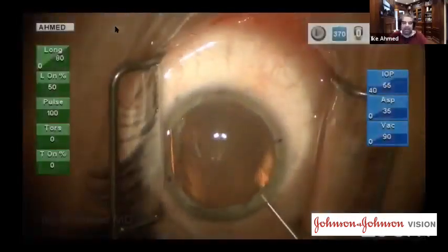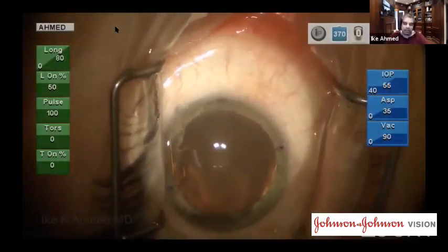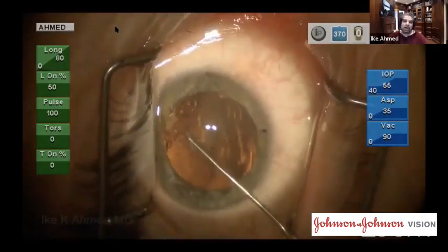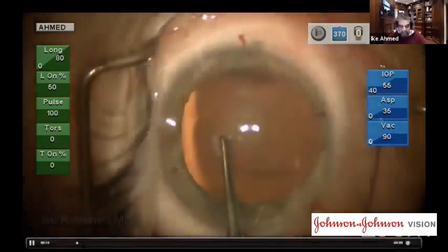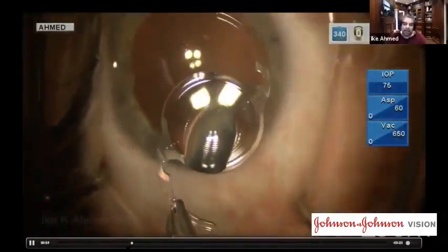This patient came to me with a traumatic cataract and an atonic pupil, was wearing multifocal contact lenses, and was very keen on getting her cataract out as well as maximizing her depth of focus. In this case, we took the cataract out fairly uneventfully. We put a CTR in. We put a pupil independent diffractive bifocal lens into the capsular bag.